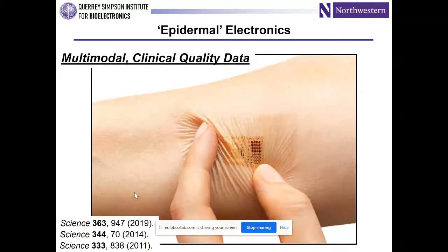But this picture is showing that very first demonstration platform. It wasn't an integrated system with direct clinical utility, but it was a platform that included all the basic building blocks that you'd ultimately want for a skin interface electronic biosensor system. It's arrays of silicon CMOS electronic components, RF diodes. I think we had strain gauges, temperature sensors, antennas, all kinds of stuff, but built into an overall heterogeneous hybrid platform, combining hard materials with soft materials, all with a goal to design a system that has physical properties precisely matched to the epidermis.